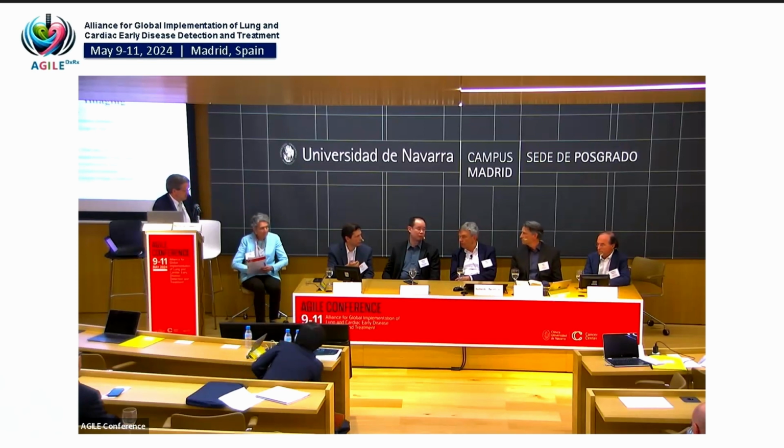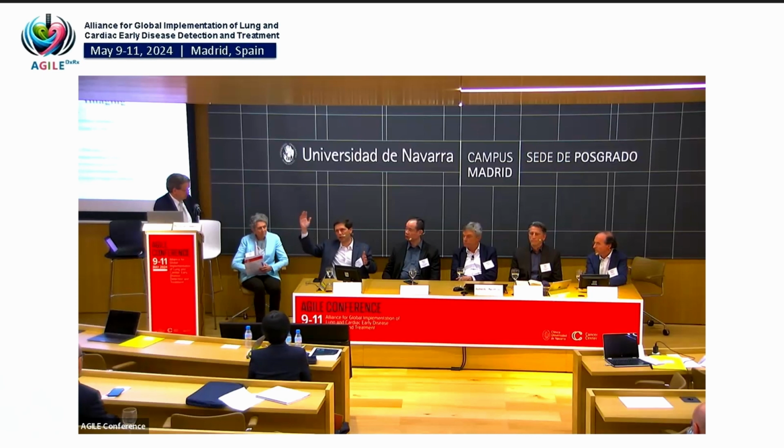No, we have 5 different reconstruction protocols afterwards. So we do separate ones for nodule, emphysema, calcium, and cardiac, all different protocols. Right. So where I'm going with this is that on one end, we have very high resolution and we can tolerate lots of noise. And on the other hand, we have emphysema, which doesn't need such high resolution usually, and can't tolerate much noise at all. So where we're headed, it appears, is we're going to collect still very high resolution data, but we're going to reconstruct it in different ways.